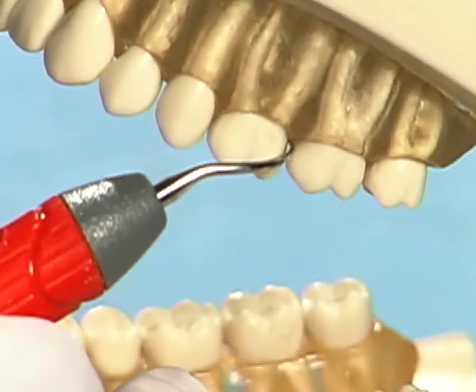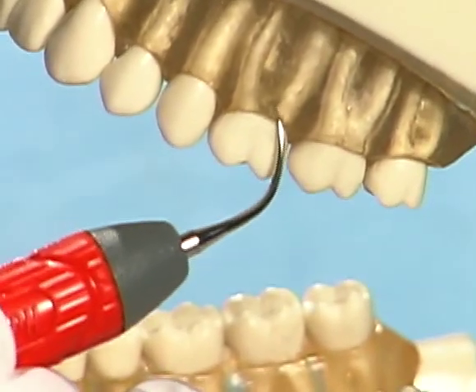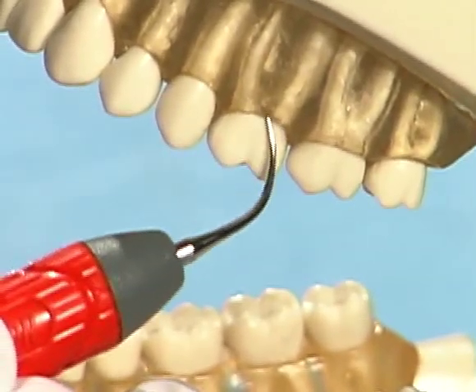Ideal adaptation will have the terminal 2 to 3 millimeters of the insert tip adapted to the concavities of subgingival root surfaces.